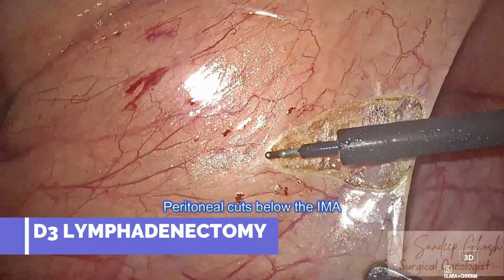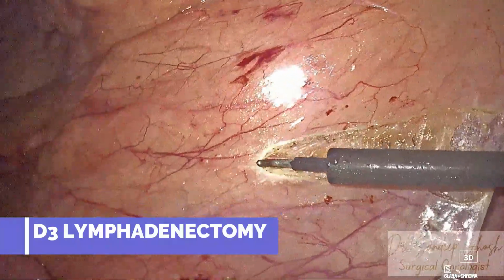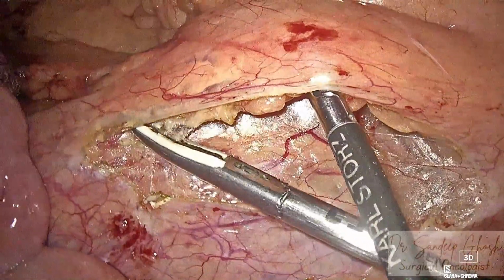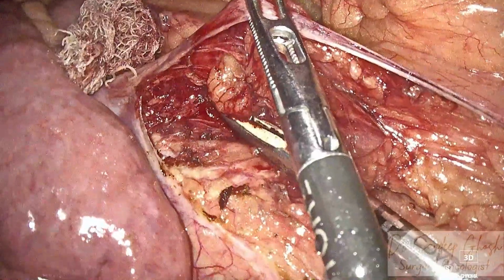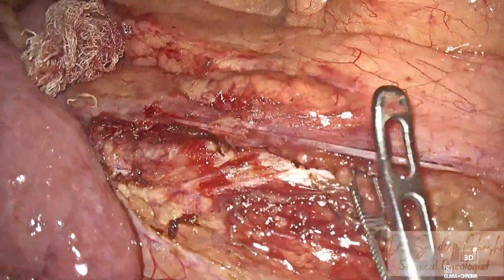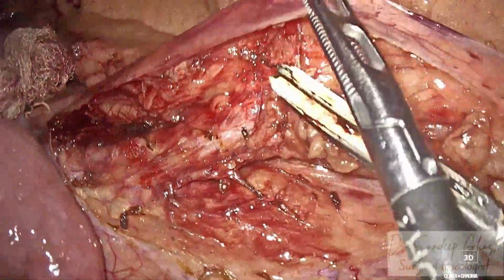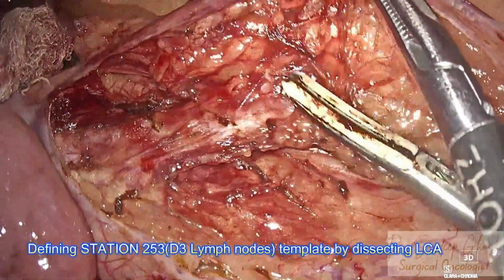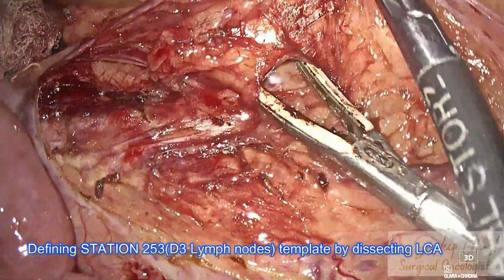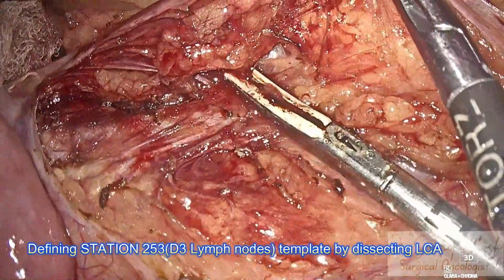We start off with the peritoneal cuts immediately below the IMA. Here we are dissecting above the IMA. We are trying to define the IMA lymph nodal packet, the central lymph node station 253. We're dissecting and defining the left colic artery here.